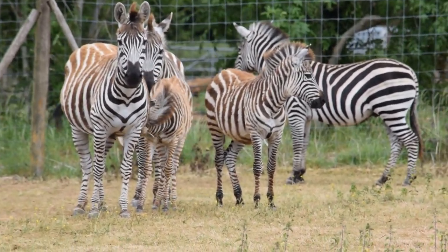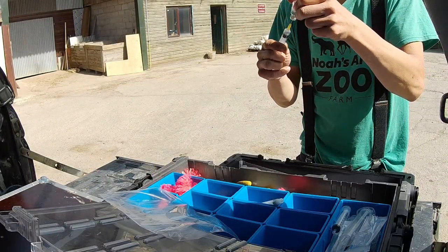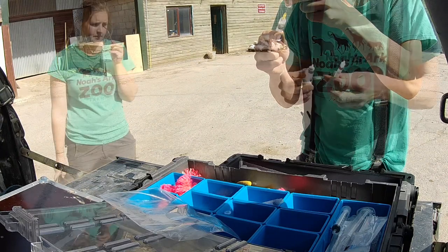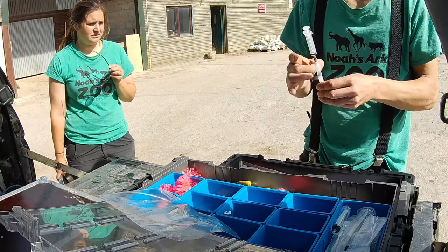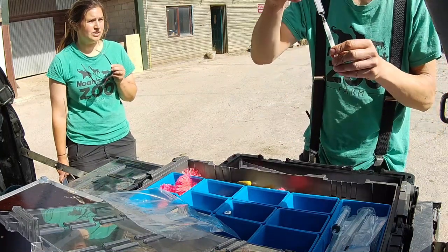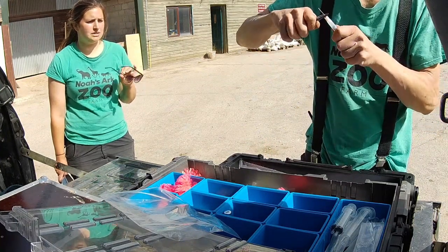I've chosen the lightest dart that we have and loaded it up with the vaccination. I've got the shortest needle that we can use on there, and the lighter dart flies a lot gentler - we won't need to pack it with loads of gas and send it fast because we should be able to get quite a close-up shot. We'll make it as gentle as possible; it will make him jump, it always does, but it won't really hurt because we're going to send it nice and gently.